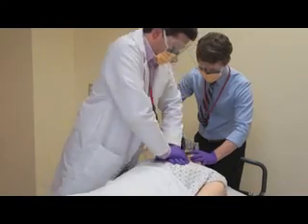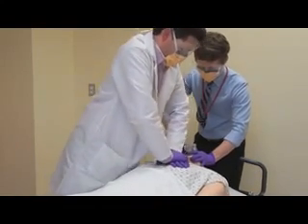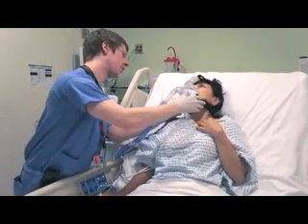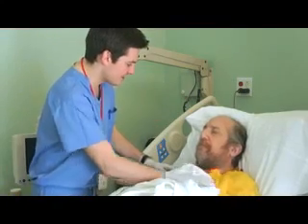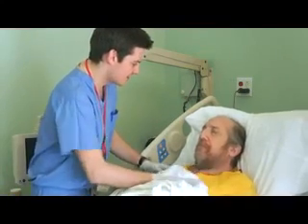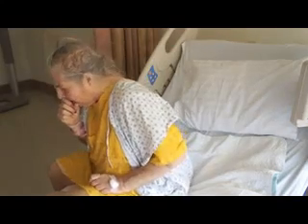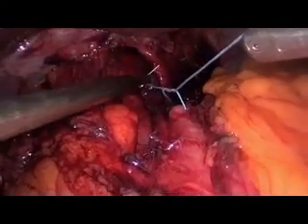The only absolute contraindications to BPAP and CPAP are cardiac arrest and respiratory arrest. Relative contraindications include discomfort from the mask that cannot be resolved with adjustments, a high risk of aspiration because of impaired mental status, except when the impairment is due to hypercapnia, a large volume of secretions, recurrent vomiting, and recent upper airway or gastrointestinal surgery.